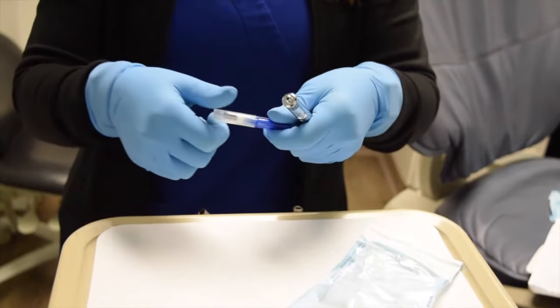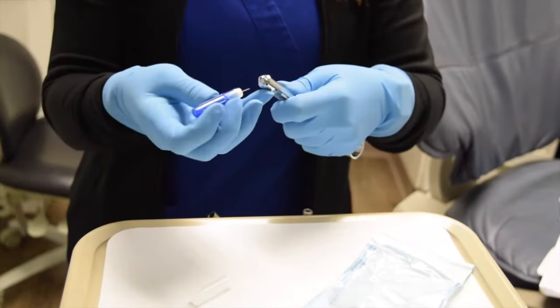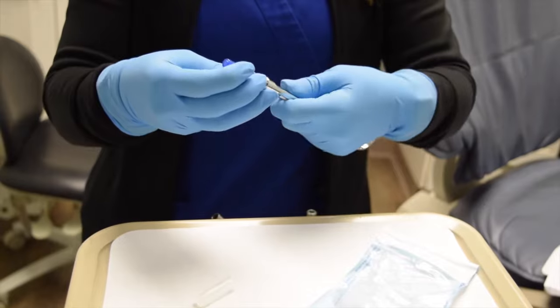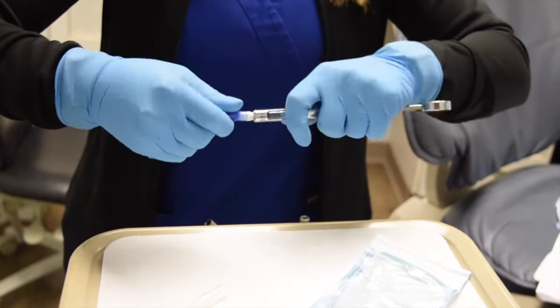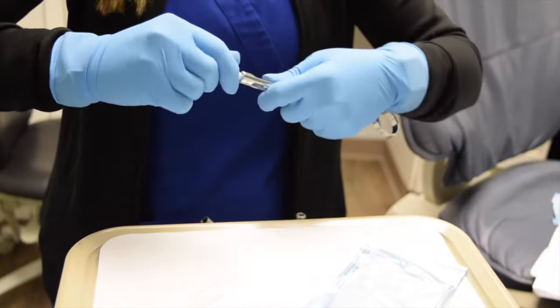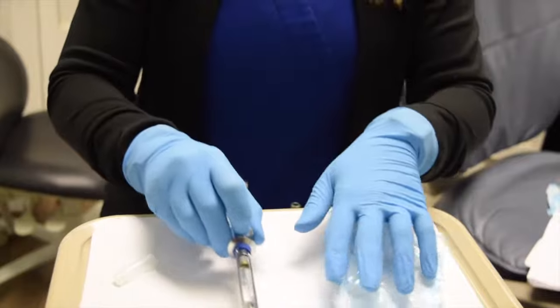You will then remove the plastic cap from the needle. Place it into the hub of the syringe and screw it all the way down securely. And then your syringe is ready for the doctor to use.